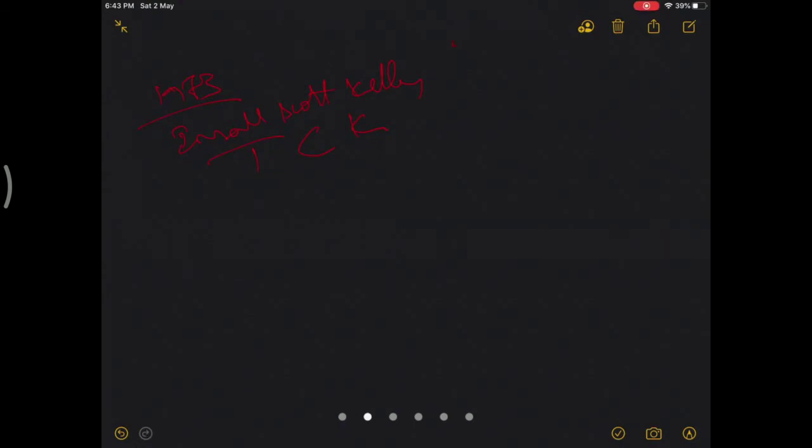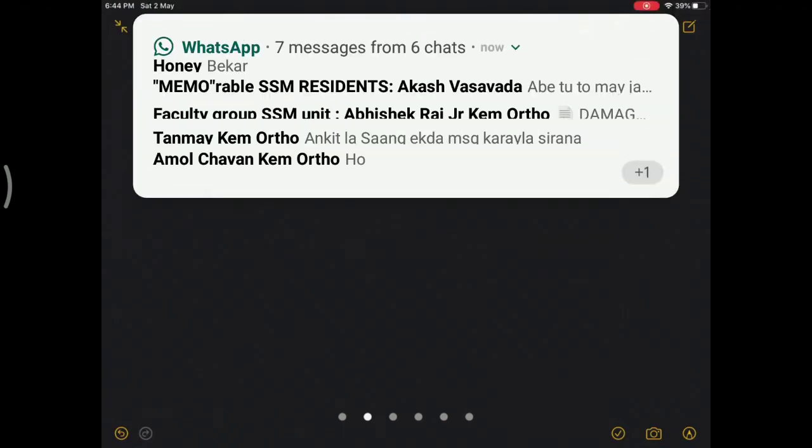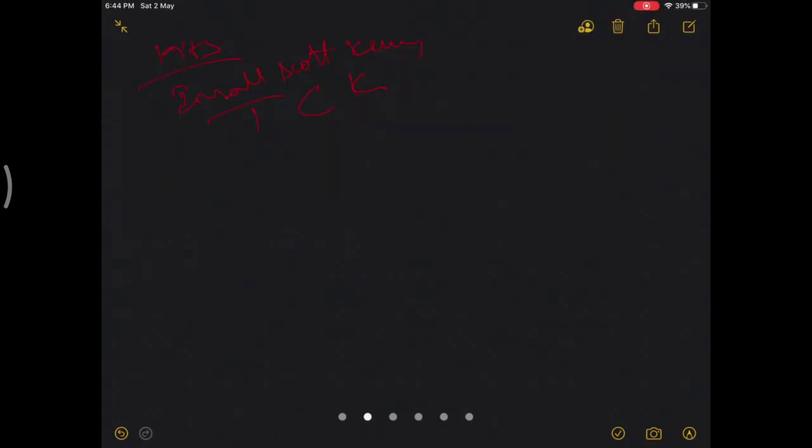So what they did is a measured resection technique, they cut as much as they replace, and the implant was a bicruciate sacrificing total condylar knee.